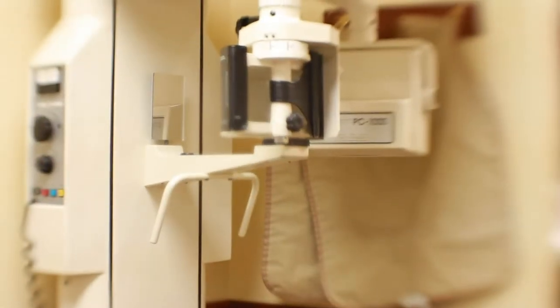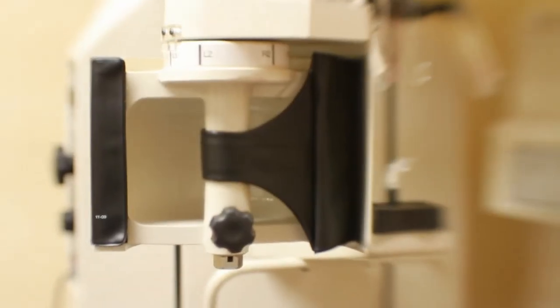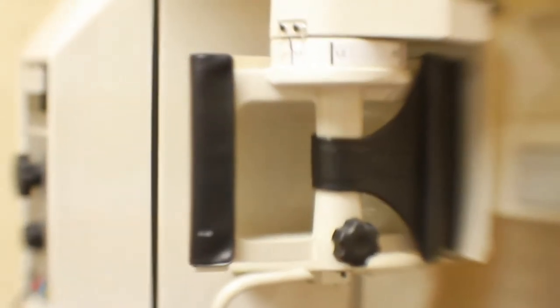The Panorex x-ray machine, or the Panorex as it is commonly referred, is the workhorse of any dental office, being used five to six times daily. This makes it an important tool to know how and why we use it.